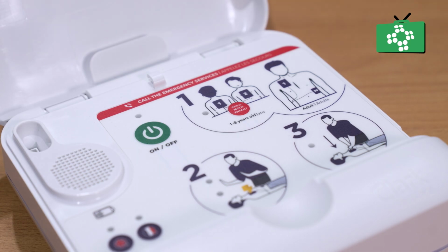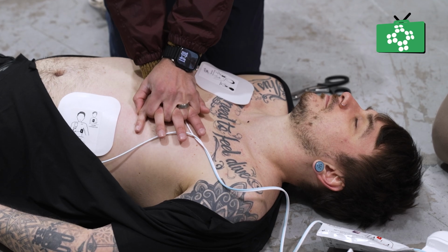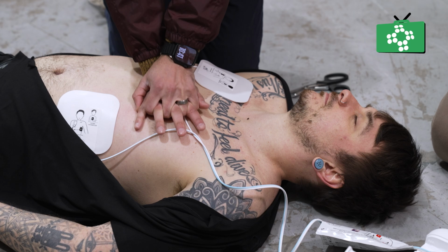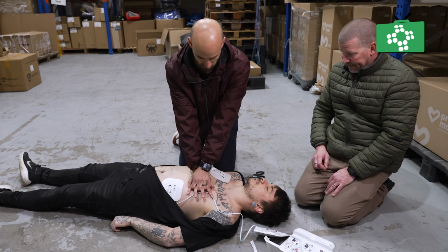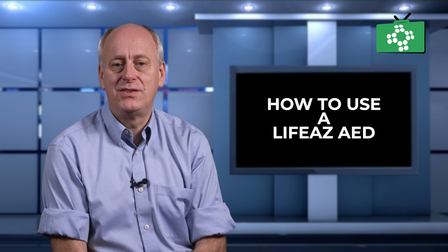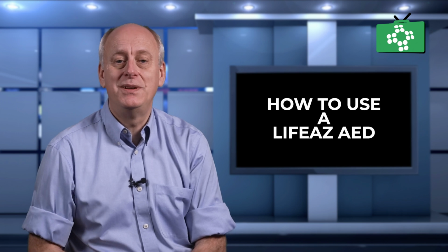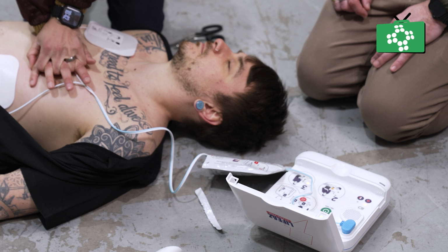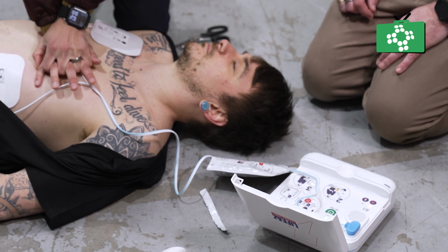After the shock is delivered, the AED will instruct you to begin CPR. The AED unit has a metronome to guide you at 100 to 120 compressions per minute. If you're comfortable doing so, deliver 30 compressions followed by 2 breaths and repeat this until the AED tells you to stand clear. If you're uncomfortable providing breaths, just give the chest compressions until the unit tells you to stand clear. The AED will reanalyze every 2 minutes and advise when another shock is needed.